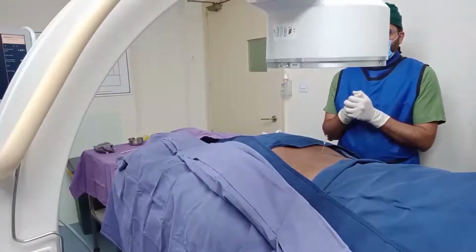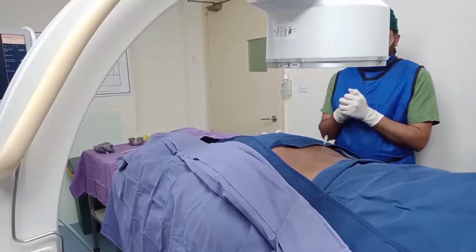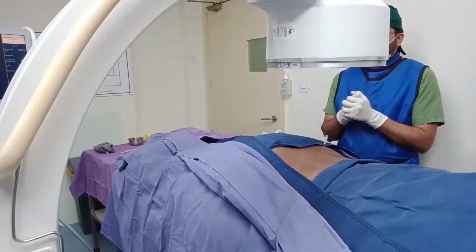After confirming on the lateral view that the needle has reached into the intervertebral foramen, we are going to take a safety view, a true AP view, to ensure that the needle is not too far medial, which may result in the puncture of the dural sheath.